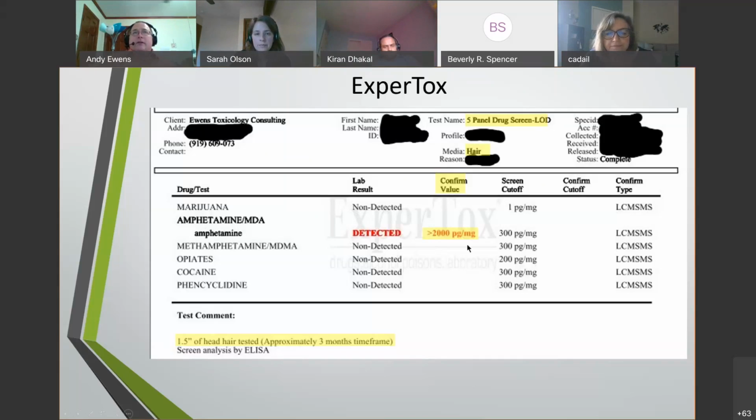So this is the information that you get. They are showing amphetamine, but not methamphetamine, which is interesting. Amphetamine is abused, but not as much as methamphetamine. If they were to report methamphetamine without amphetamine, which is a metabolite of methamphetamine, then you would have to question the results and whether or not that was a valid test. Since without the metabolite, something did not work right.